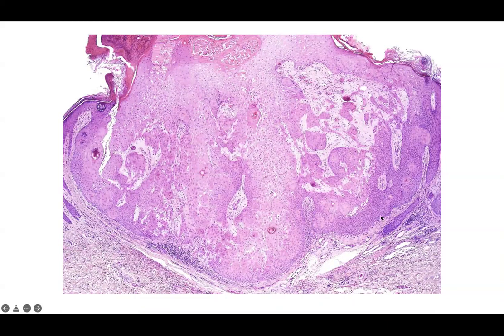It's endophytic, that can be worrisome, but if most of it is bland and you've just got some squamous eddies and a true lack of parakeratosis and keratin pearls, and you're not seeing a malignant acanthosis or malignant acantholysis pattern, then you're probably dealing with an inverted follicular keratosis.